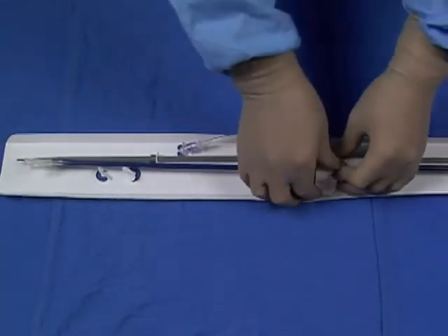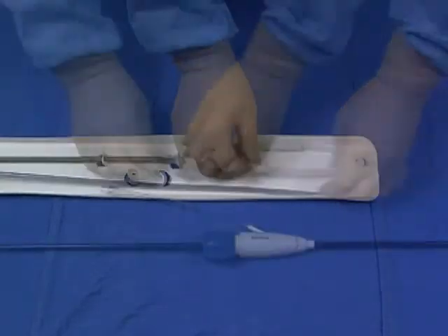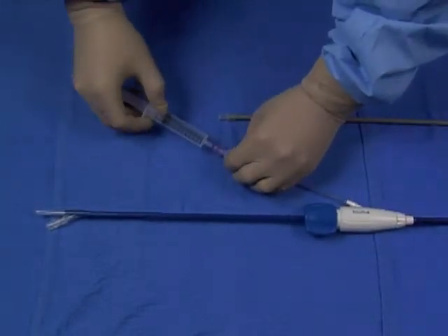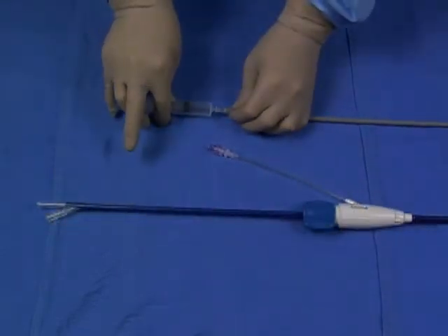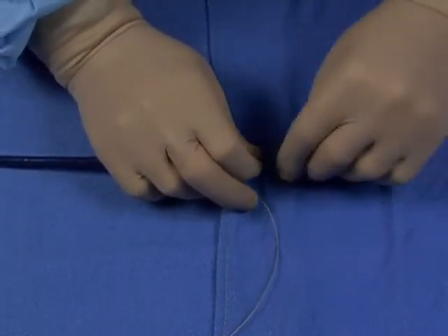Confirm and open the appropriate device, then release the handle cover to unpack the delivery system and the dilator. Flush the side port and the central lumen of the delivery system, and then flush the dilator. Load the delivery system onto the stiff wire and keep the side port medial.